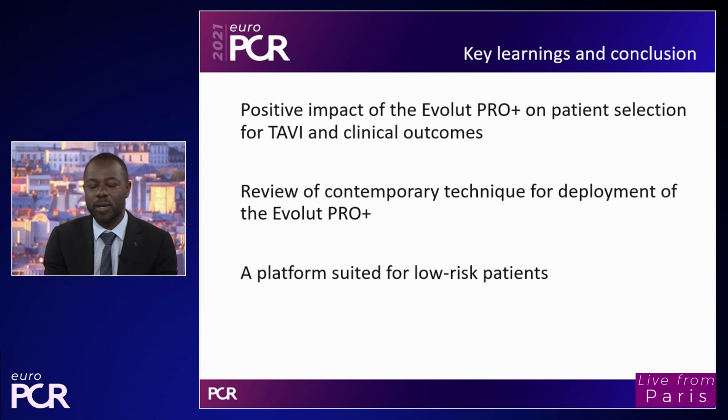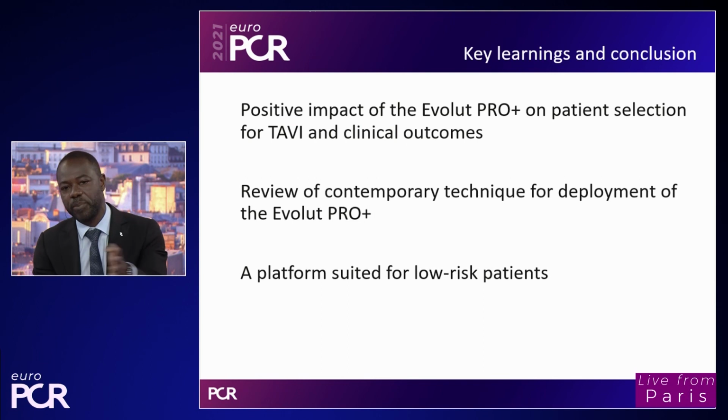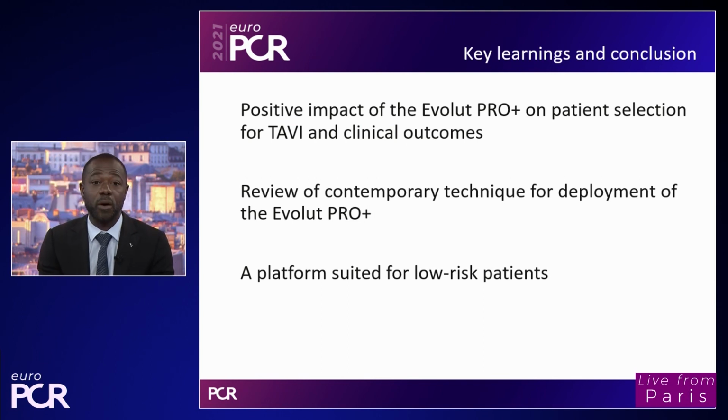And at last, we could understand through the presentation of the interim analysis results of the Optimize PRO study what we could expect in terms of outcomes for lower risk patients: hemodynamics, clinical outcomes such as stroke, death, PVL reduction, and early discharge, because lower risk patients, younger ones, are going to be more mobile, and we need to take quality of life into consideration.